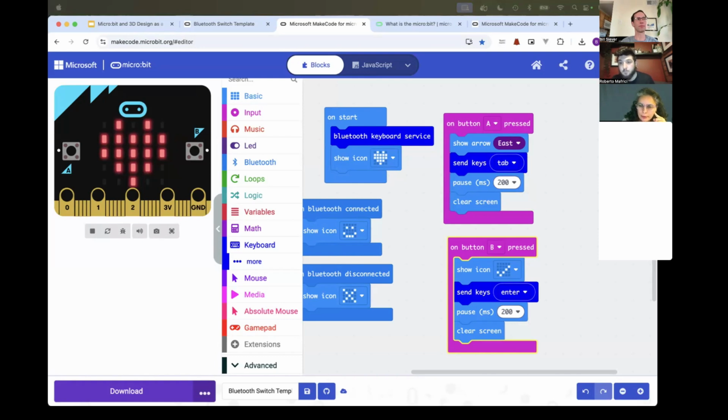the difference between Arduino AVR and the Microbit. Oh, sure. The Microbit actually runs a much more sophisticated processor than the Arduino AVR does. The reason it's useful here is that it's a pretty good price point, around $20, and the Bluetooth support is really what adds the ability for it to do the switch access.